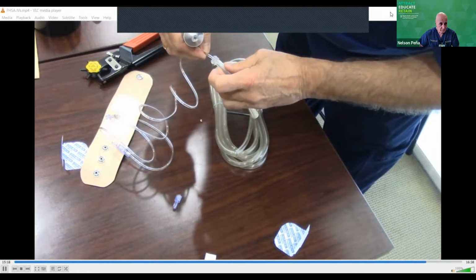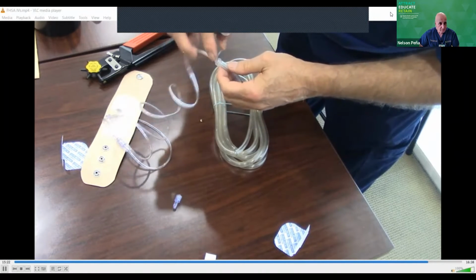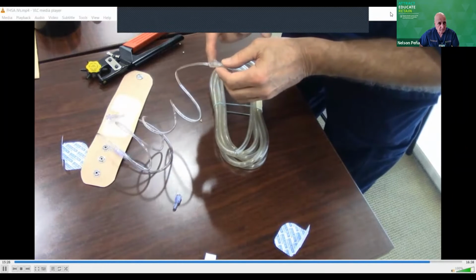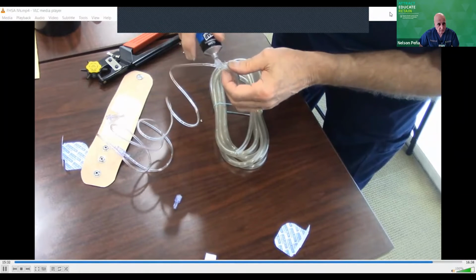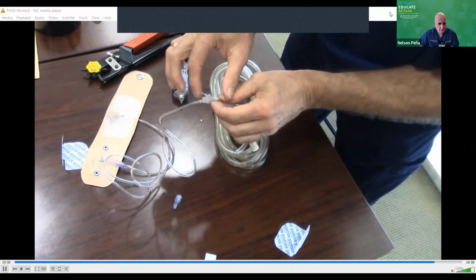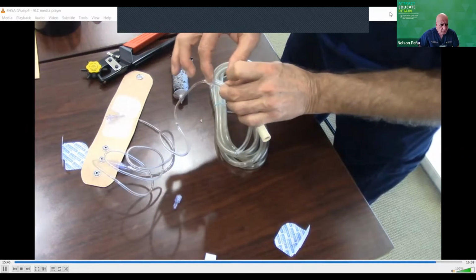And you can shove it in a little further to help it grab. And I usually like to force it in with my fingers. I'd like to get as much in that tubing, the suction tubing, as possible. So if you force it in, you're going to get a nice good connecting seal and it won't pull apart on you.